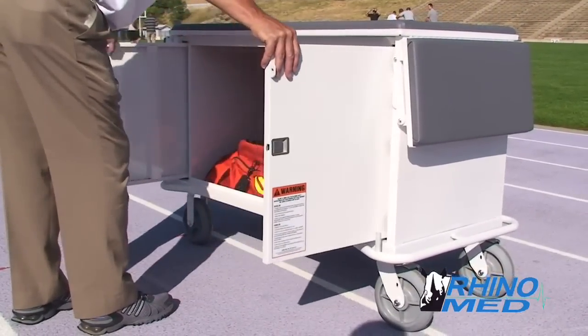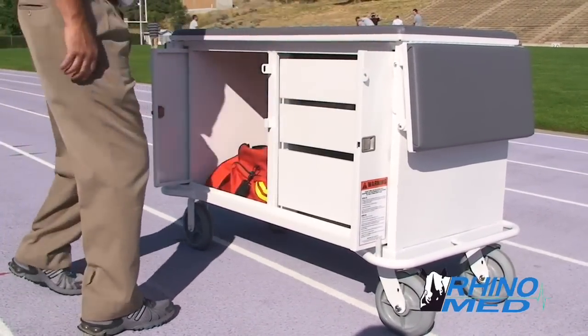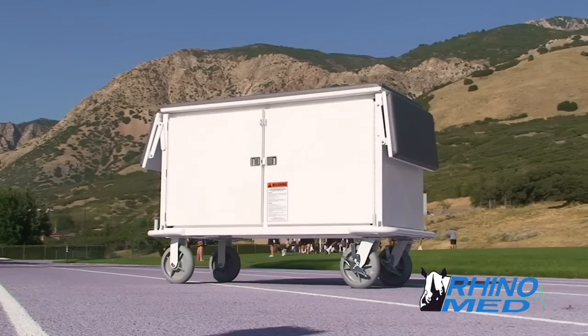Locking doors slide out of the way for easy access to supplies. The doors also lock to protect equipment and supplies.